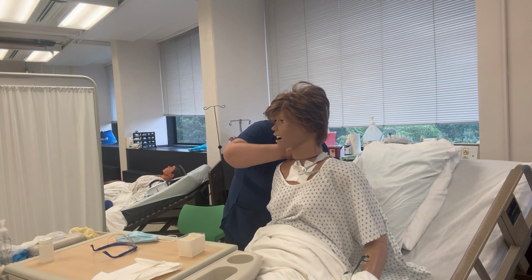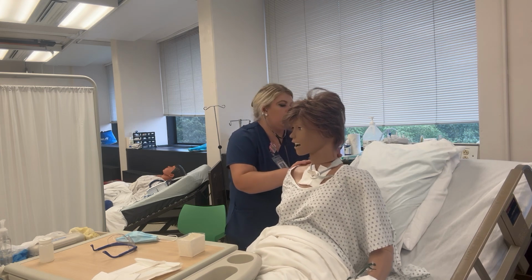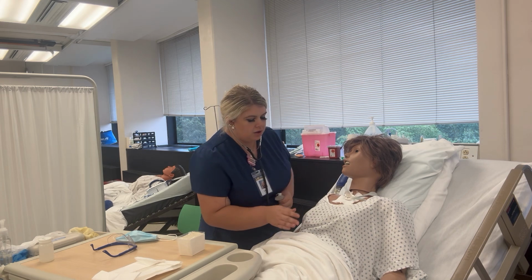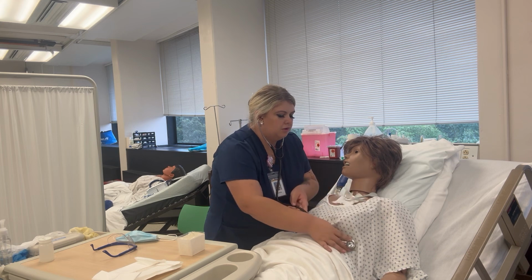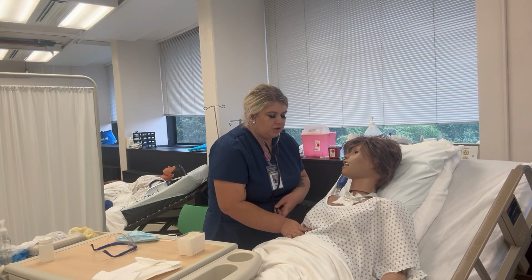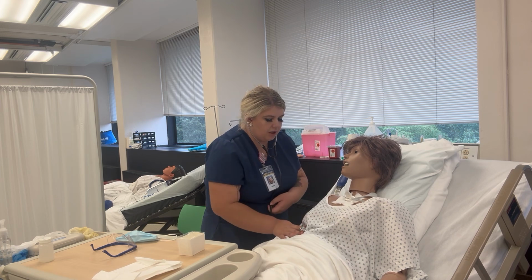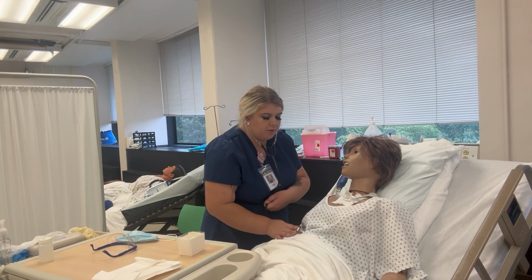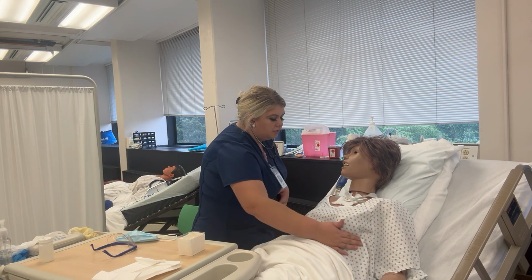Good. Still no masses or lesions. We're going to do another big deep breath to see chest expansion, making sure that our hands are rising. Lower back down, and we're going to do the same thing in the front. Just looking again. Go ahead and listen. Want to make sure that the wheezing or congestion doesn't sound as bad after doing the suctioning as prior. That would indicate we needed to do another pass. And then again, just feeling.